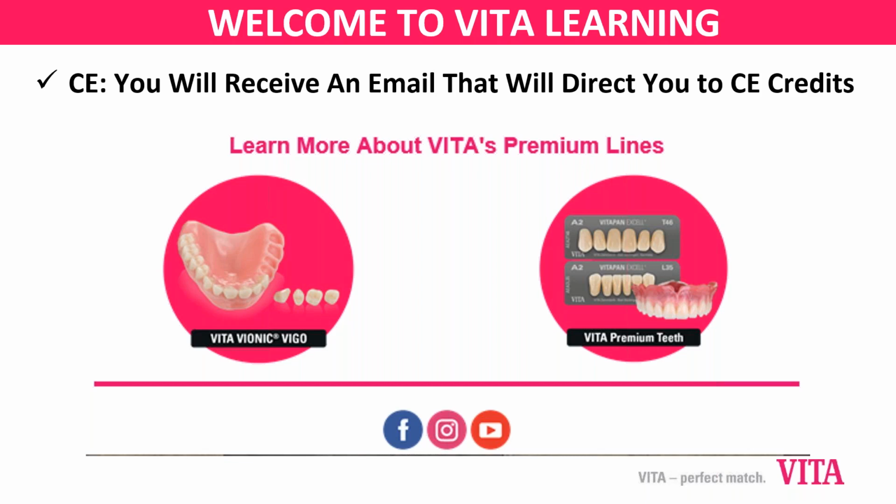Yep, definitely. So I'm going to pronounce their name wrong, so forgive me. Is it Risha? If you have to do an adjustment, do you need a special burr? Okay, so the answer to that question is no. However, you do want to use as fine as you can. You don't want something that's got big teeth on it, because you will leave big striation cuts, microscopic.